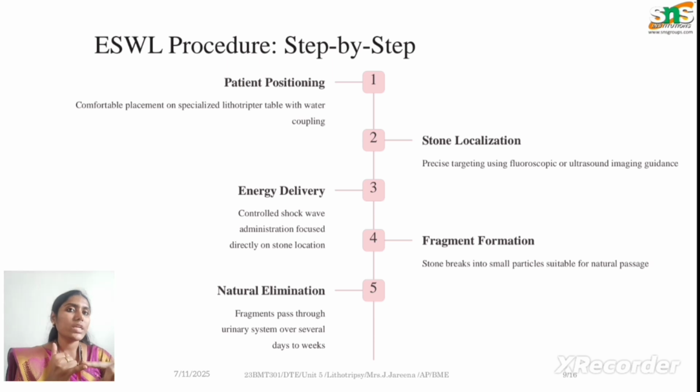First, positioning is very important before starting the treatment. The patient should be made very comfortable, and then made to lie on the lithotripsy table with the water coupling, because the water coupling is the focusing system.